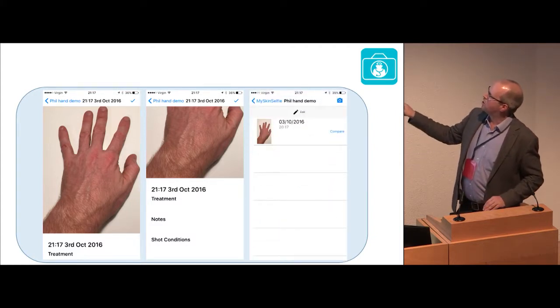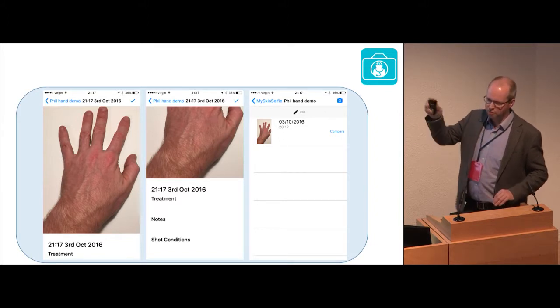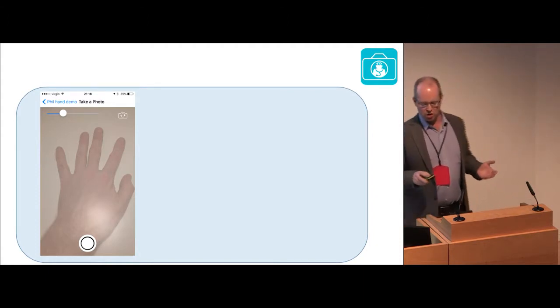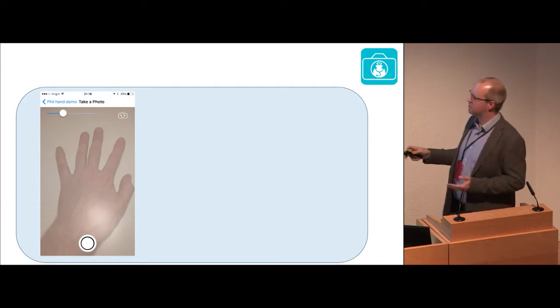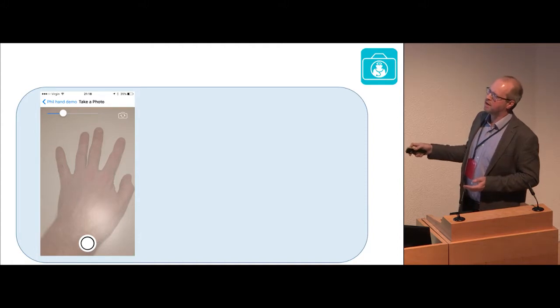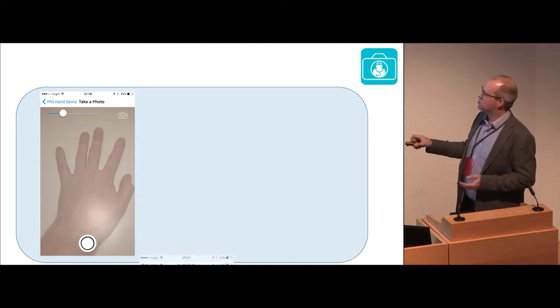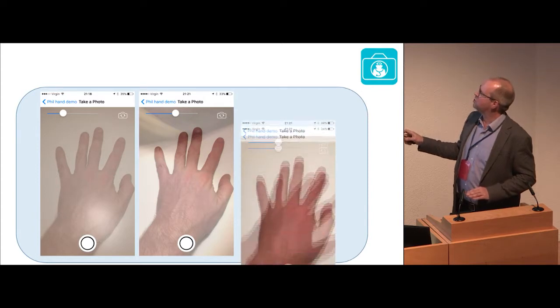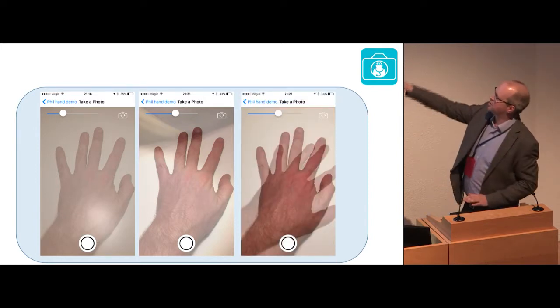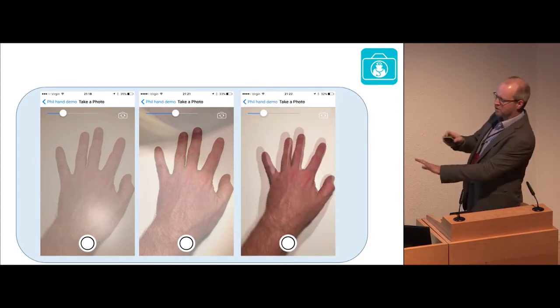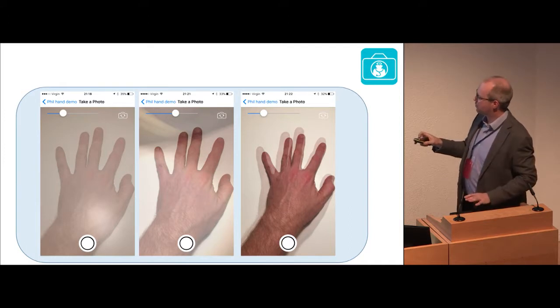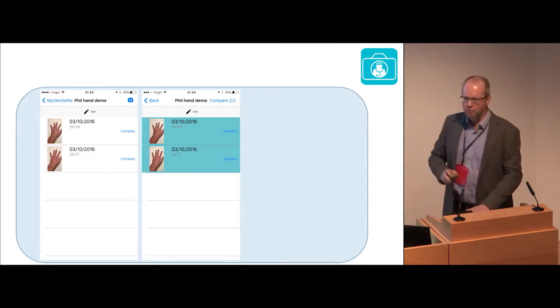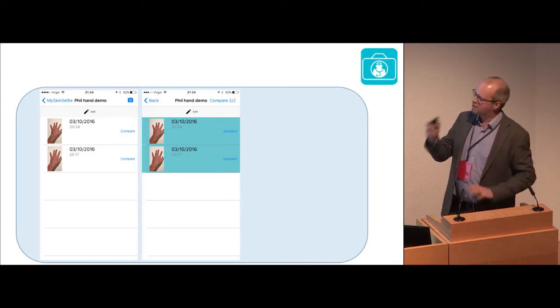You get a little thumbnail, and as you accumulate images they all stack up in a line you can scroll through. When taking your next image, we have an image consistency function called an onion skin or template. This is the first image faded out slightly, with a slider bar to make it clearer or remove it entirely. You then line up the second image — you can see the first image in the background and gradually move it until you get a complete overlay. With a bit of practice you can get images that line up quite well, which helps consistency particularly for faces, hands, and similar areas.